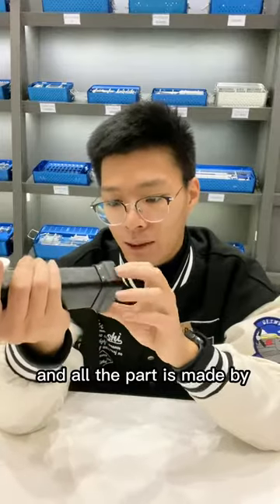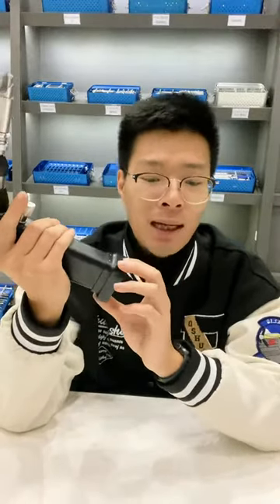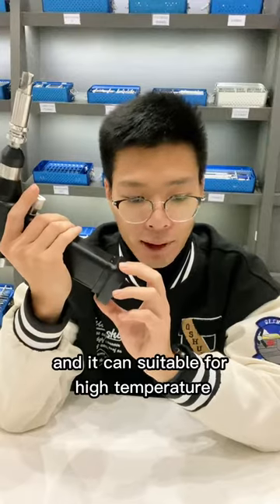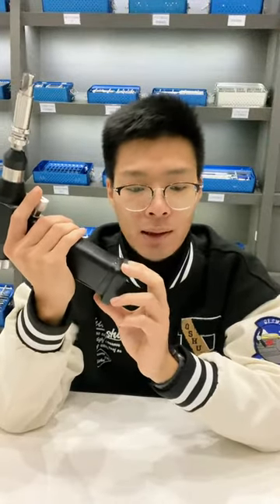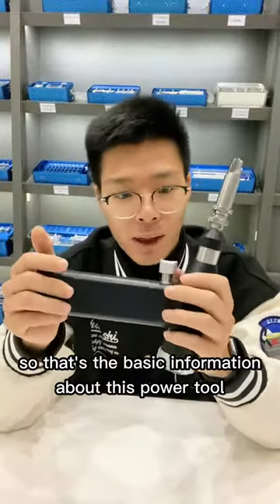All the parts are made of aluminum and it can be suitable for high temperature sterilization. That's the basic information about this power tool.